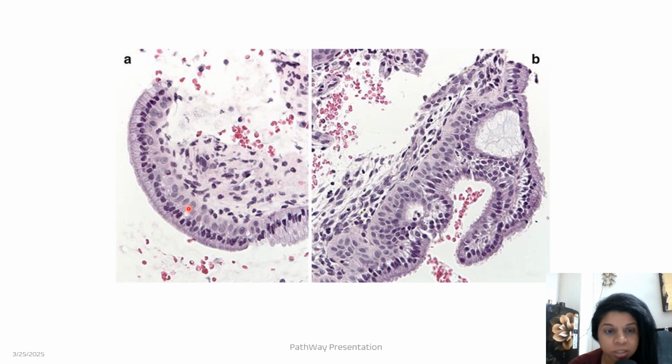And then here is the reserve cell layer, which is proliferating, undergoing hyperplasia, and getting converted into squamous differentiation. That is why you are seeing endocervical cells above and reserve cell hyperplasia here, which is becoming squamoid. This is also a little rare. Normally, you don't get slides showing such reserve cell hyperplasia.